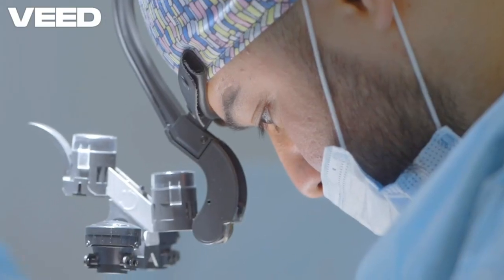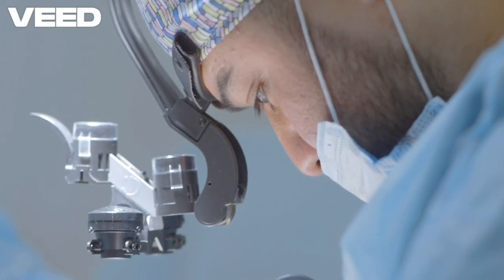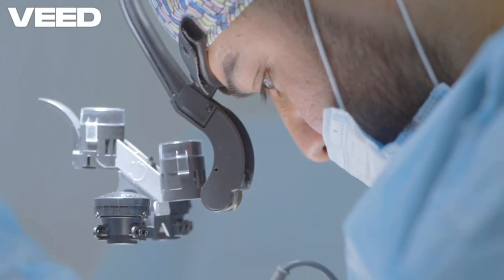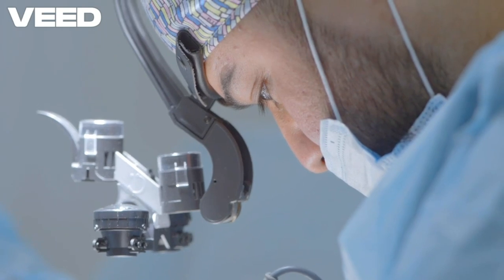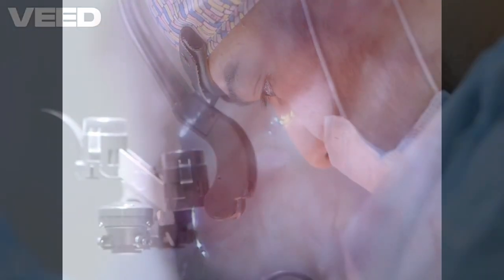Depending on the technique, the graft is placed either under or over the remnants of the eardrum. A middle ear packing, like gel foam, might be used to hold the graft in place and ensure it adheres well. Once the graft is secured, the incision is closed and the ear is dressed to protect it during the healing process.